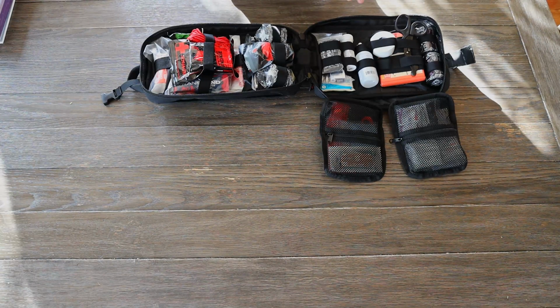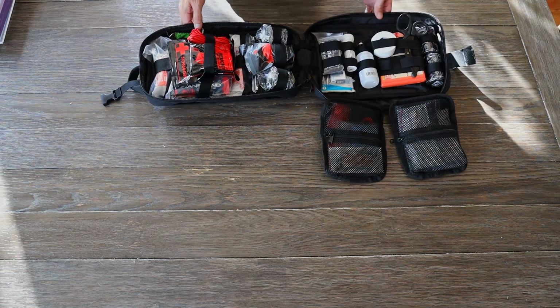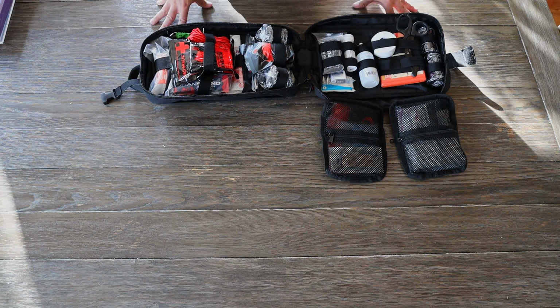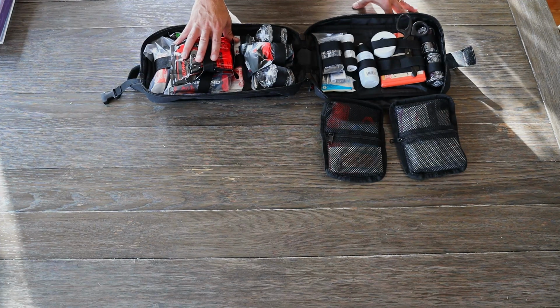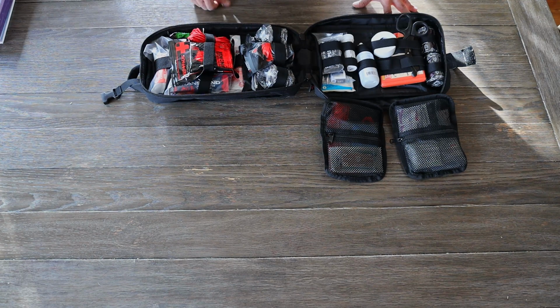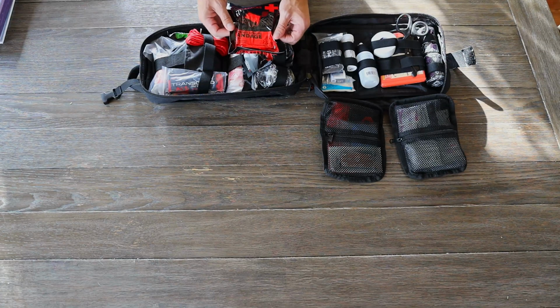Remember, I'm not medically trained, so if you're going to use a kit like this, go ahead and make sure that you either get medical training or only use what you're able to based on your training. The great thing with having a kit like this that's overly prepared, even if you aren't trained in it, is say you throw it in your car and you're first on the scene of an accident, or you've got it at the range. Even if you may not be trained on everything in here, you might get another passerby or another person that is trained to use it, just doesn't have the equipment with them, so you might still be able to use it. So starting over here, emergency pressure bandage.